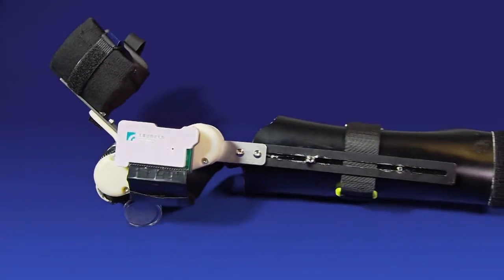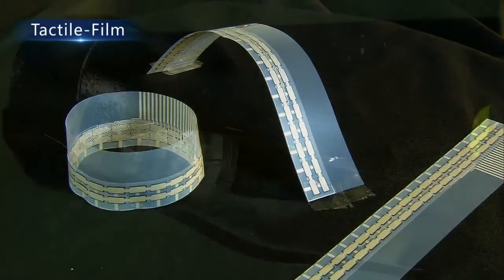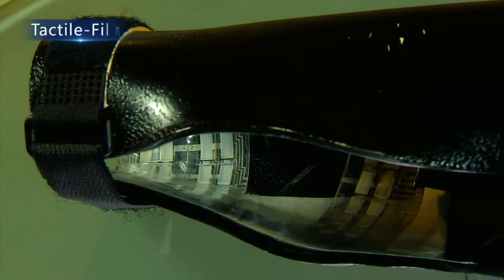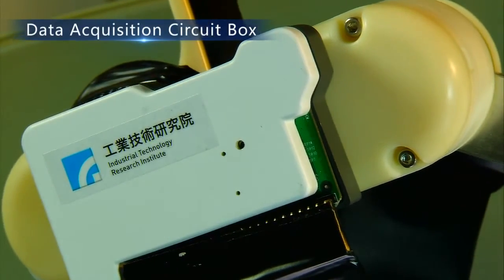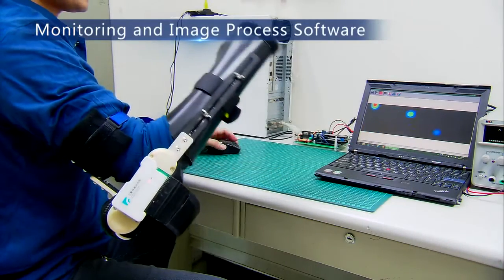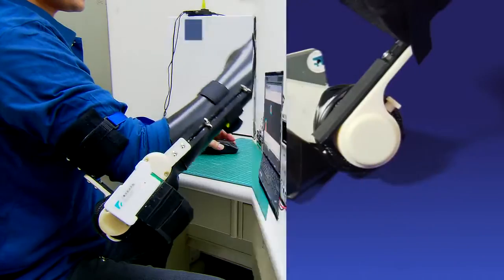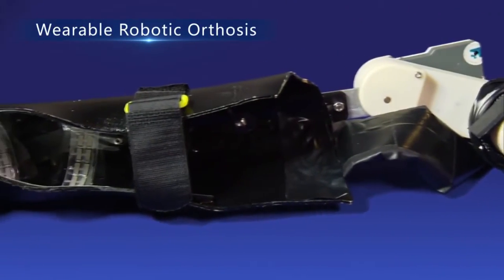HSTS consists of four primary components: the tactile film attached to the inner side of the bracket, the data acquisition circuit box, the monitoring and image process software, and the wearable robotic orthosis.